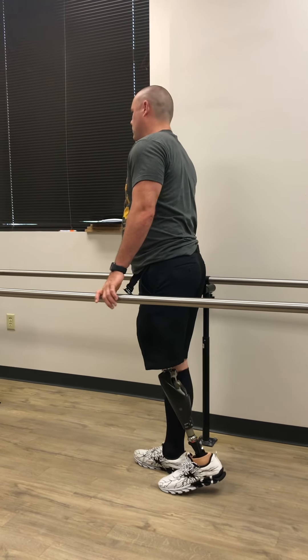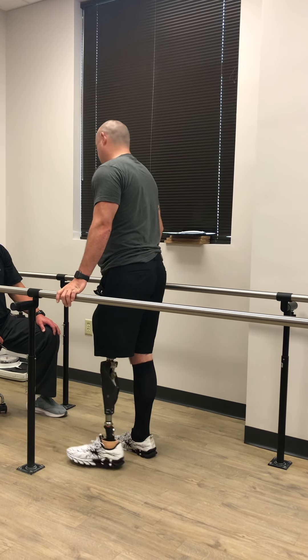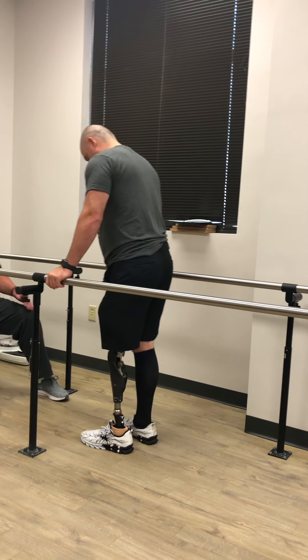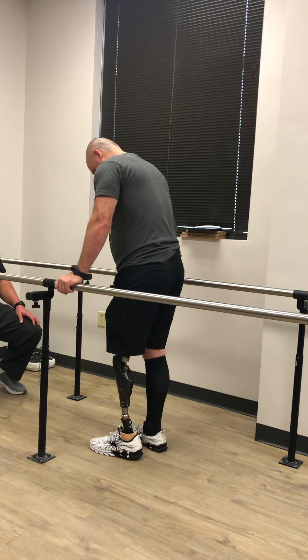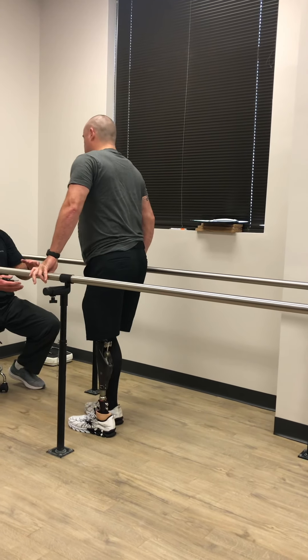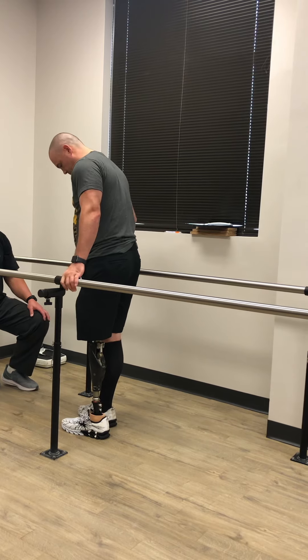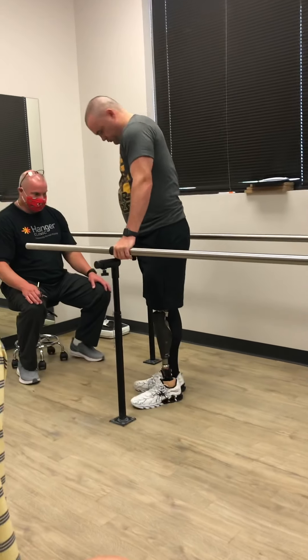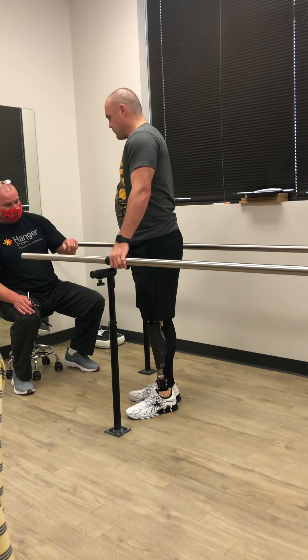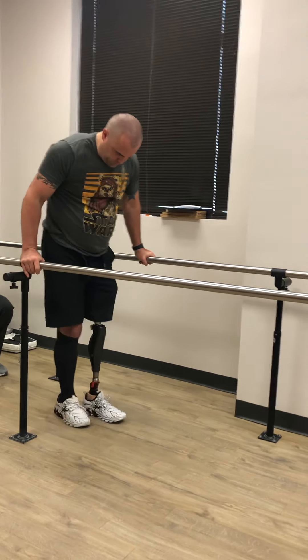How's that feel? It's a little long now. That's just a quarter inch — you can see now it feels long, so we've got to find that perfect middle spot. Let's shorten it about an eighth — we'll meet in the middle. I'm going to hook everything up and do some programming so we can walk. I'll also take that little shell down a little bit. Your check sockets didn't have that, and they bring that frame up real high, which I ask them every time not to do.